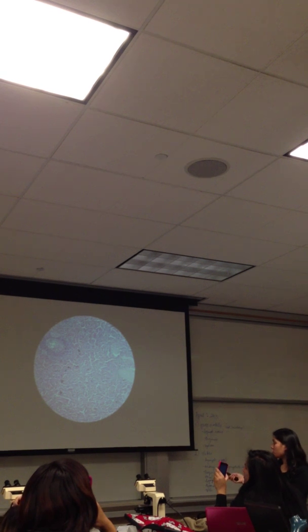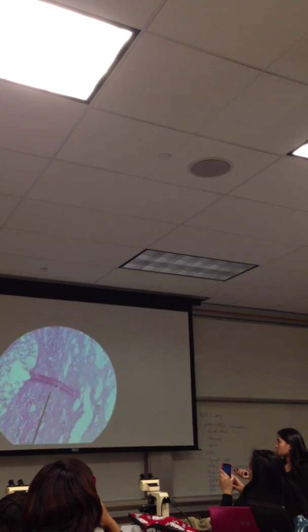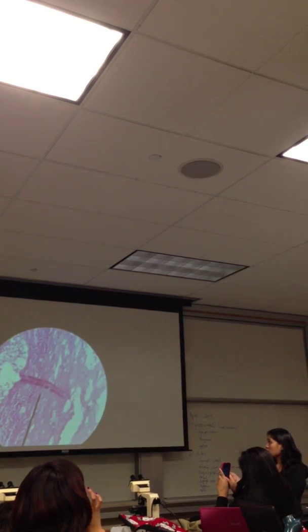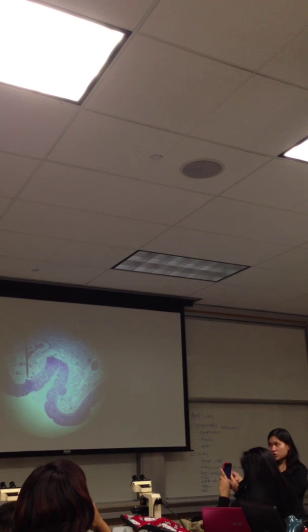I'll show you the lymph node again. Hold on, let's go through everything. You remember this? That's easy, right? Can't confuse that with anything. This one. Remember this? This one's easy. That one you shouldn't confuse with. And then this one.